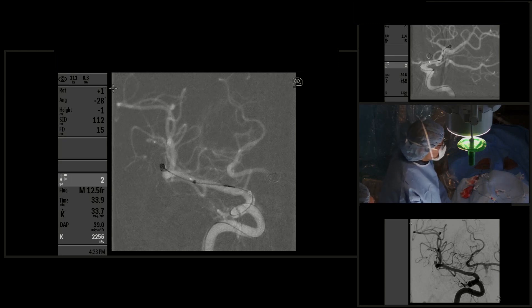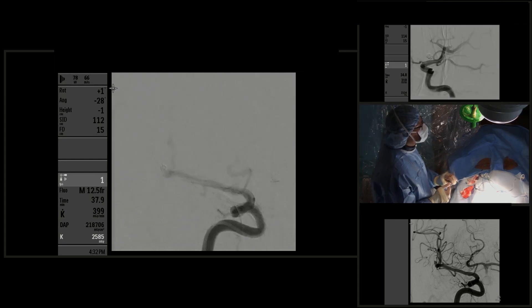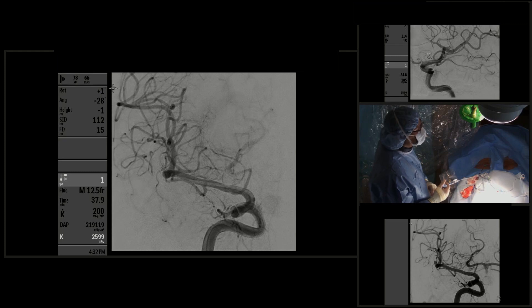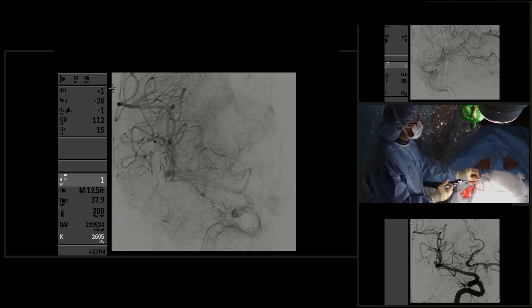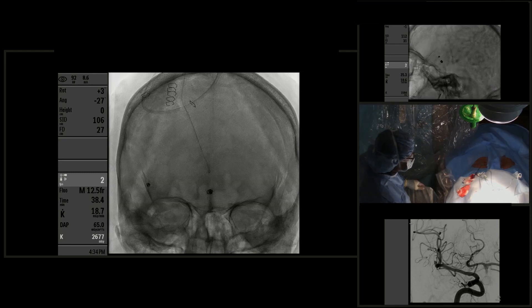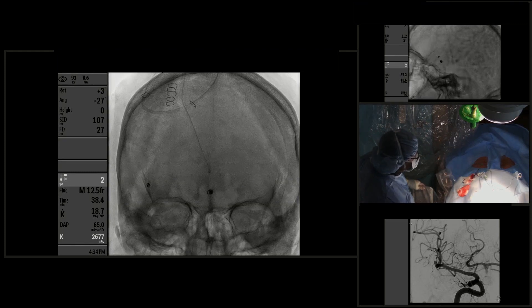As the coil is advancing into the aneurysm, you see the DSA examination showing obliteration of the aneurysm. This was a good result for endovascular embolization.